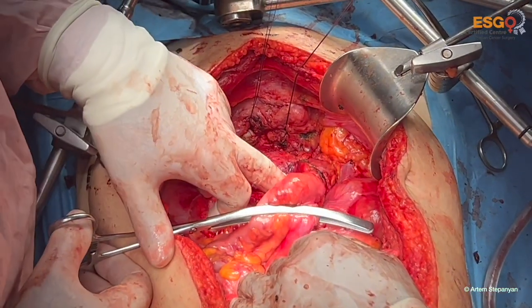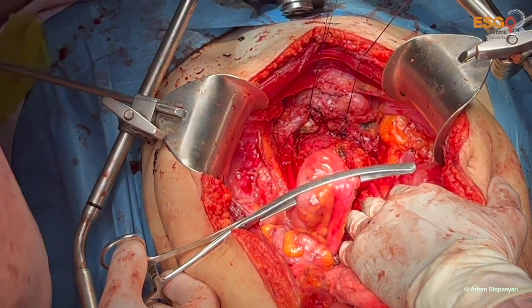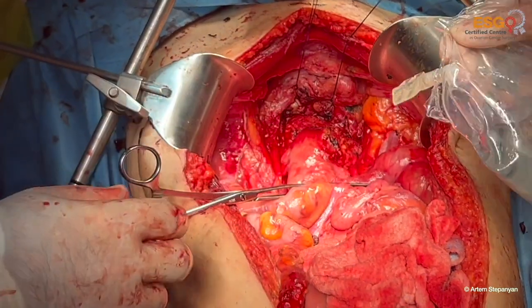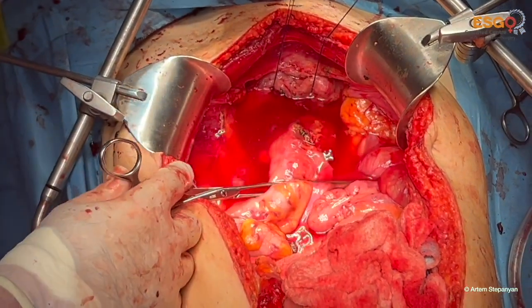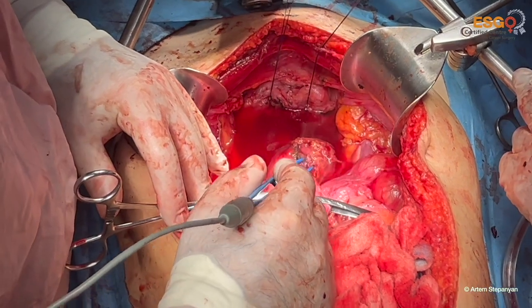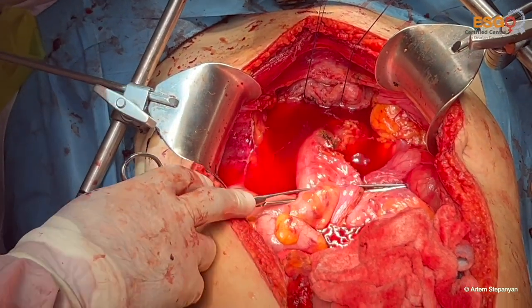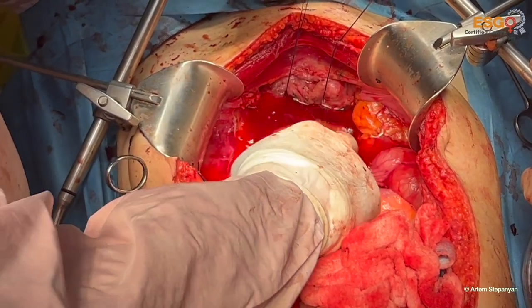Well, the bowel is okay. And at least we perform the bubble test also. Of course, this is not the case, we don't have any anastomosis, but it works to invest a little bit of your time to perform all those safety check procedures. The bubble test is negative also.